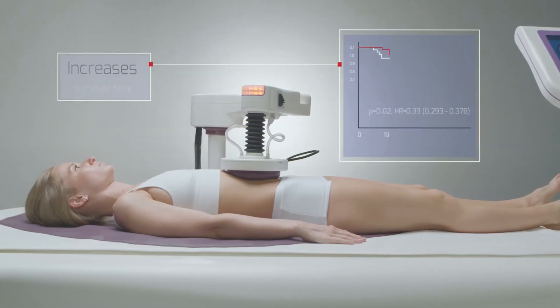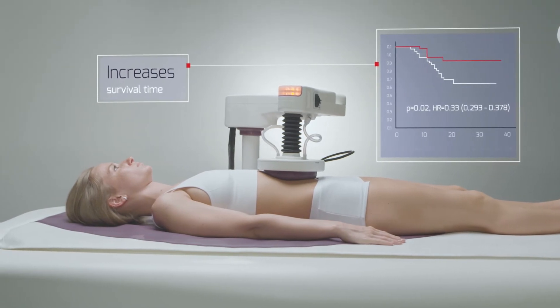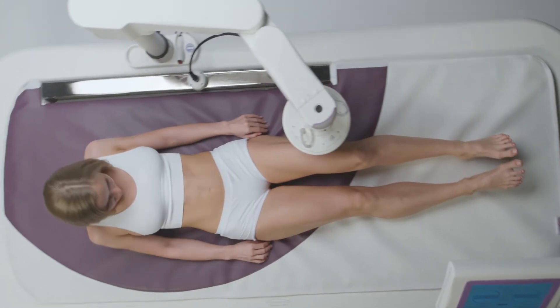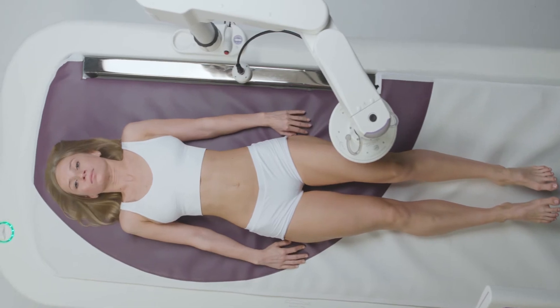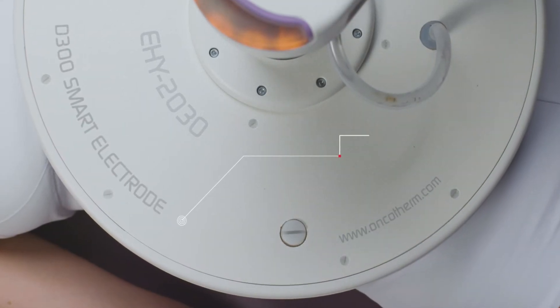Clean lines and form, a redesigned tuning system which is capable of faster and more accurate targeting. The new concept in oncology hyperthermia is the smart electrode system.